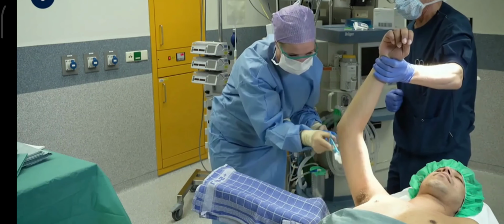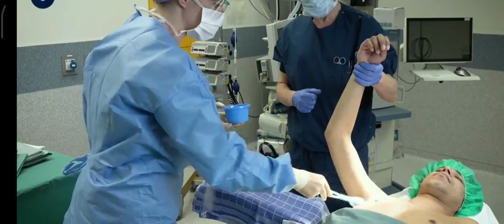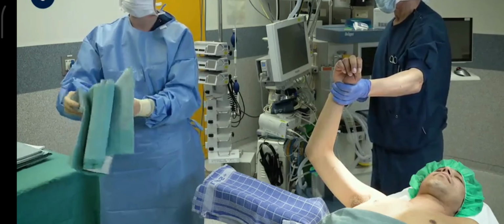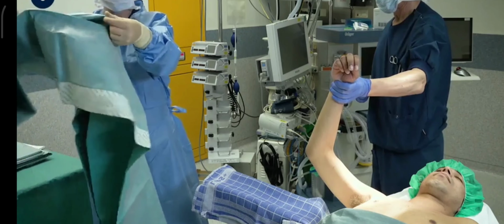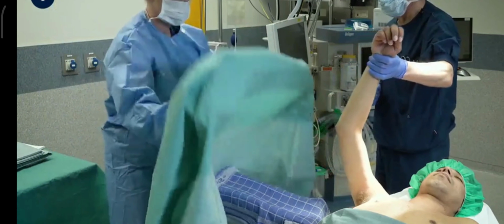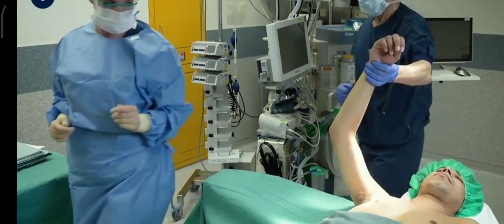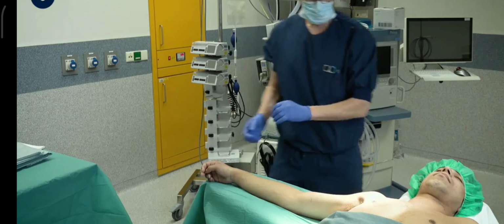Cleaning progresses circumferentially, and because it is the least clean area, the axilla is cleaned last. The assistant gives the scrub nurse space to position the unfolded drape. With that drape fully unfolded, the scrub nurse positions it over the arm support and tucks it underneath the patient. Only once the scrub nurse is safely out of the way does the assistant then carefully place the arm onto the drape.